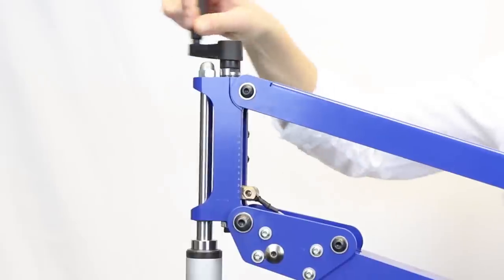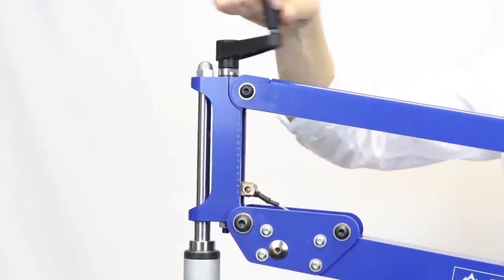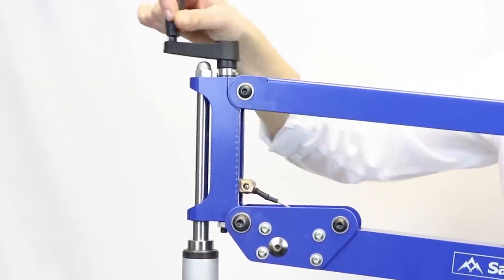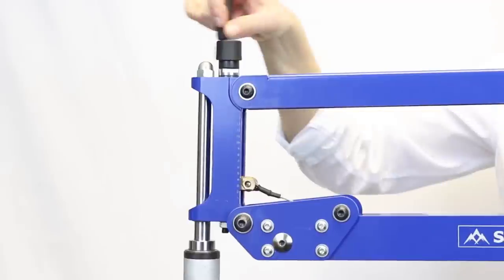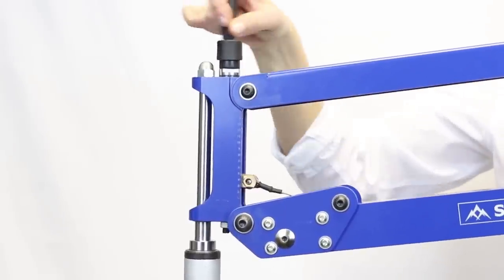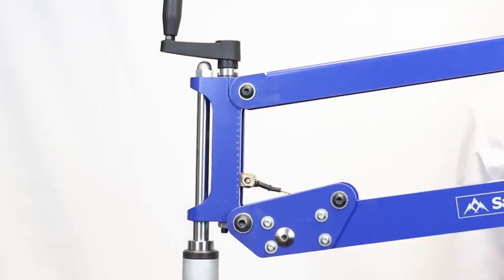Then if you want to give them more assistance to move through range keep increasing the tension handle up. As they improve over time you can start to reduce the tension on the tension scale.